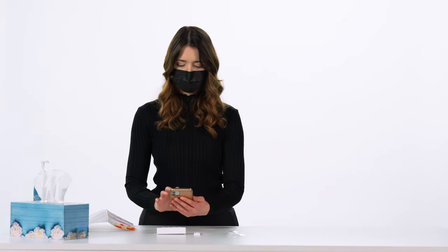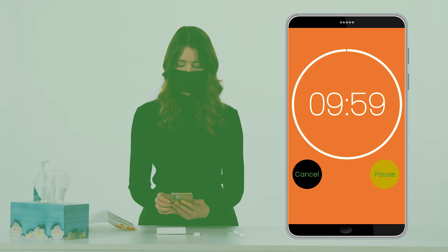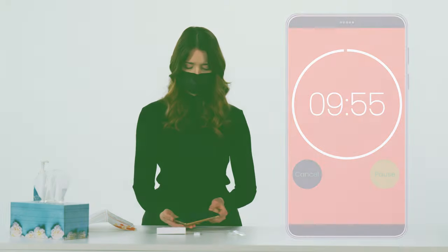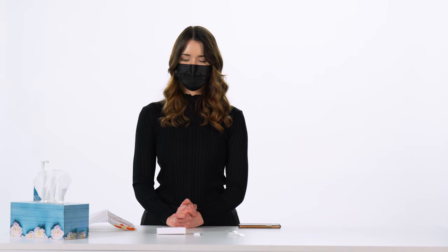Start a timer for 10 minutes and read your results once the timer is complete. Don't read the results more than 20 minutes after adding the sample. Do not move or touch the test cassette while the test is running. While you wait for your results, wash your hands thoroughly with soap and water or use hand sanitizer for 20 seconds.